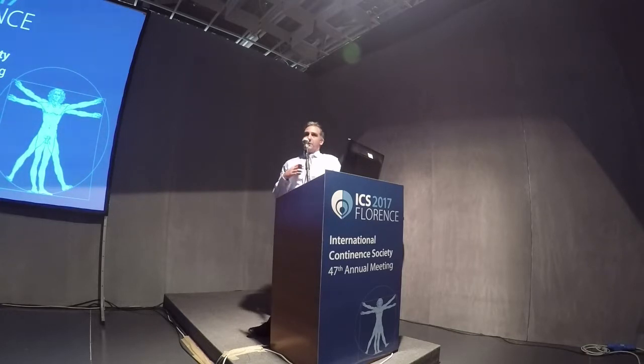So we've changed how we manage a lot of these patients now, and they would make sure they have their conservative treatments first before going, and we would use the ultrasound at the moment as our first line for investigating their pelvic floor symptoms, rather than going for MRI proctography or the fluoroscopic proctography. One, because it's cheaper, it's easier to do, and we can do it ourselves in outpatients. Yeah. At the moment, our confidence isn't high enough to use it alone.